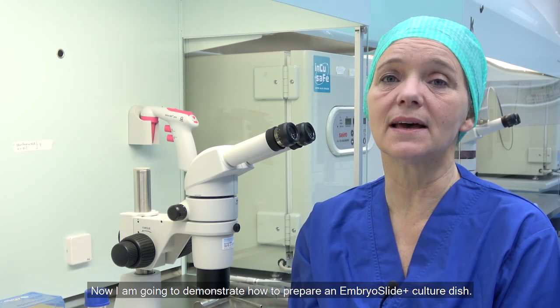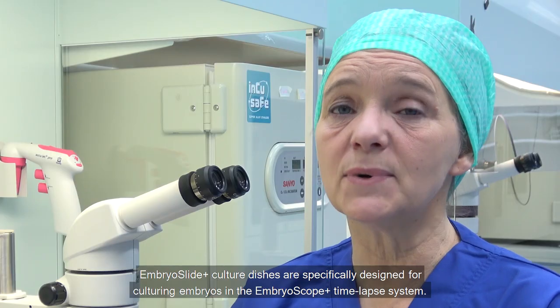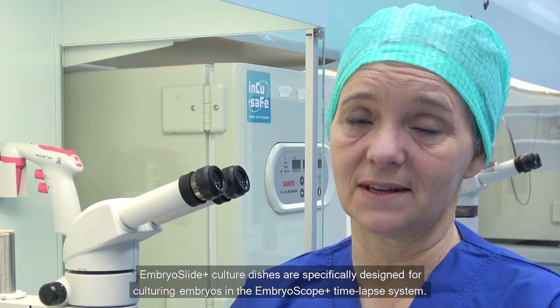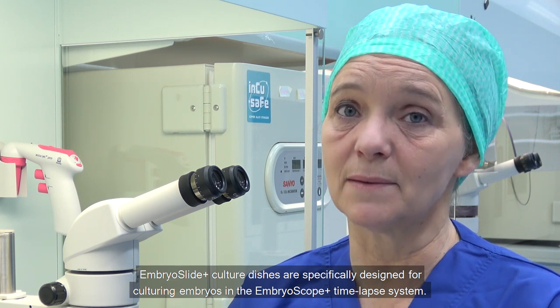Now I'm going to demonstrate how to prepare an EmbryoScope Plus culture dish. EmbryoScope Plus culture dishes are specifically designed for culturing embryos in the EmbryoScope Plus time-lapse system.